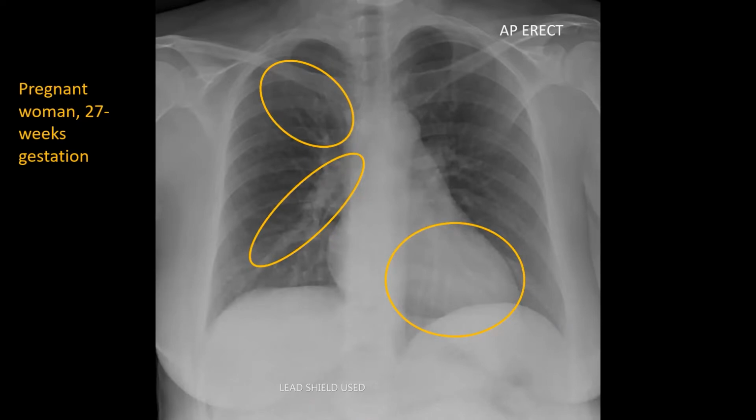And I'll take a moment too to briefly mention, if you were concerned about something hiding in the right upper lobe behind the clavicle, you might obtain what are called lordotic chest x-ray views, which give you a better look at those upper lobes behind the clavicle. And again, one more chest x-ray is a tiny little bit of exposure that is not felt to be harmful to the fetus at that dose.